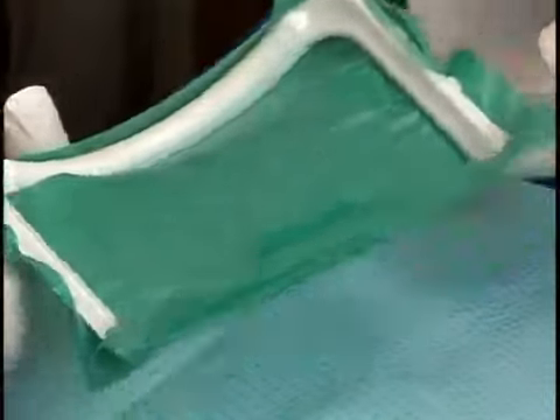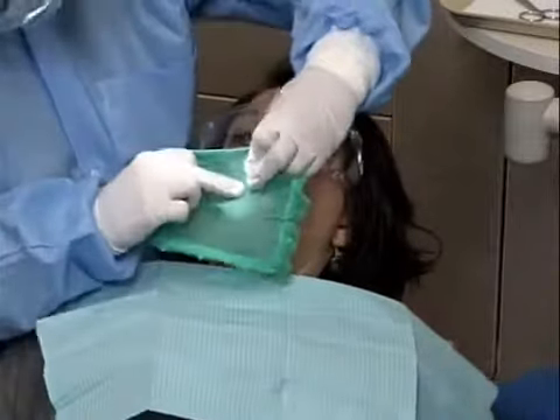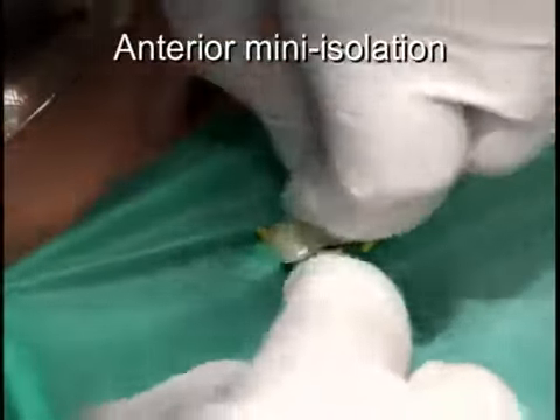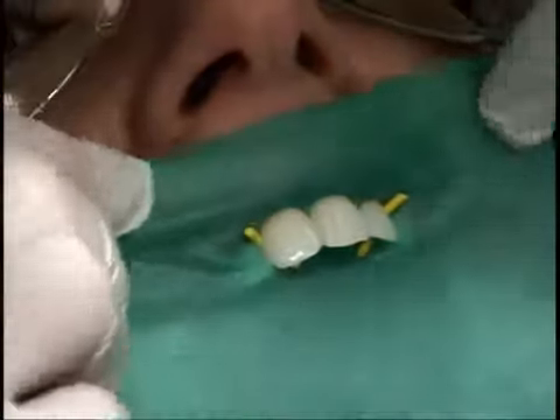Place the dam on the frame, punch holes, apply lubricant, and carry the dam and frame to the mouth as one unit. Place a Wedjets cord on each end of the isolation and use floss to place the dam interproximally. Invert the dental dam by tucking under the gingival edges of the dam.